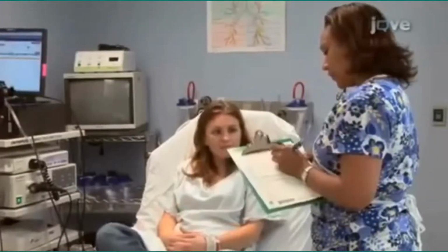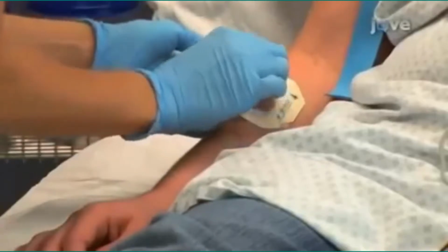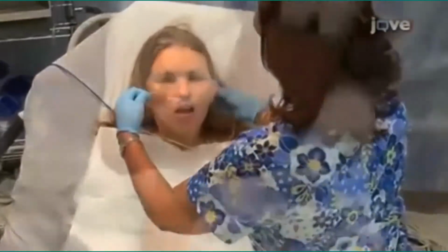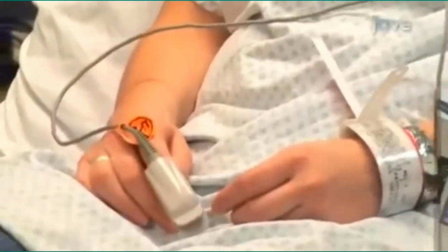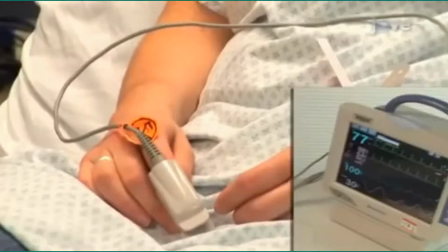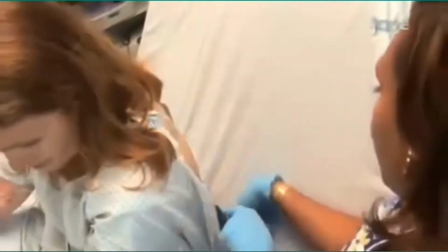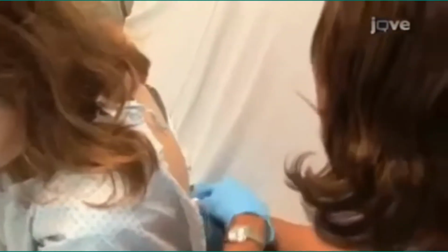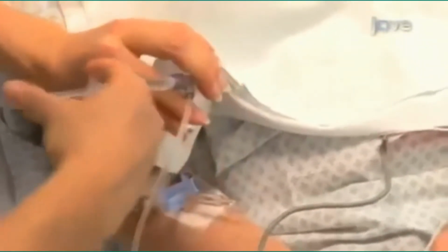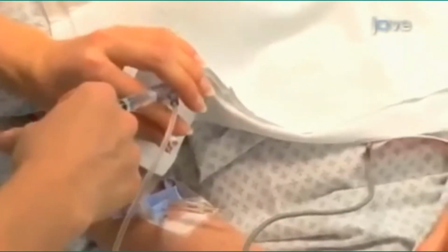After the patient's chart is reviewed, the patient is prepped and a peripheral intravenous line is placed. Patient is given supplemental oxygen via oral or nasal cannula and is placed on appropriate monitoring for sedation. The patient is monitored with continuous electrical cardiac or EKG monitoring, continuous pulse oximetry, and continuous intermittent non-invasive blood pressure. A gel-type return electrode is placed on the patient and connected to the Alair RF controller for proper functioning of the Alair system. Once the patient is prepared, the sedation is typically accomplished with IV midazolam and fentanyl.